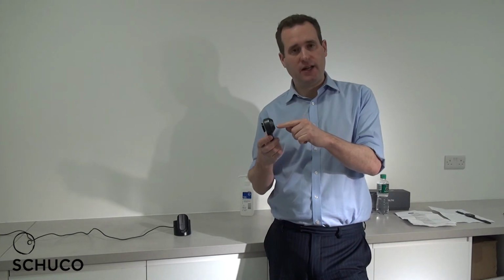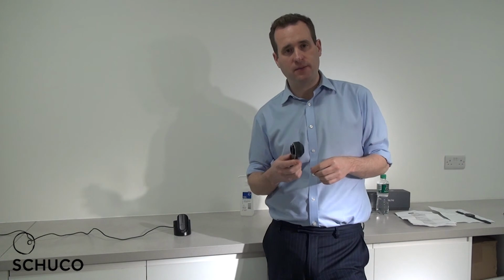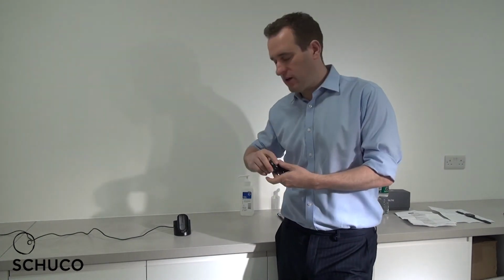After you have finished taking your picture, it is important to make sure you clean your dermatoscope. If you get an alcohol wipe, you can gently clean the lens to make sure that there's no residual gel or dirt on the dermatoscope, and then you can place it back on charge for when you next use it.